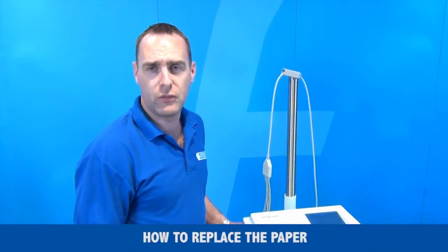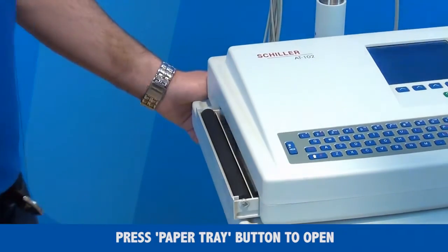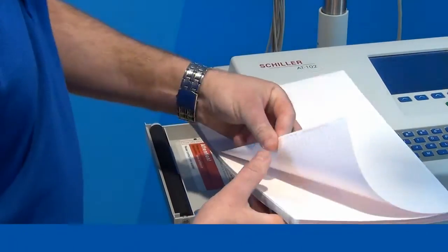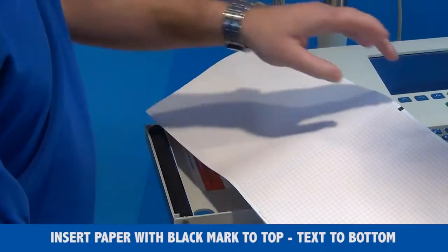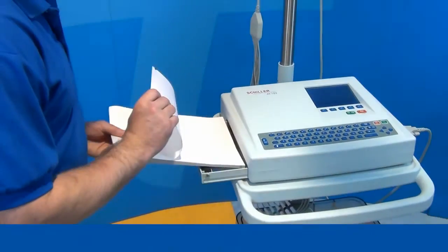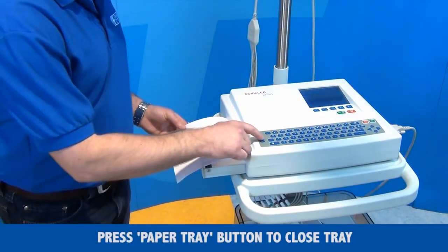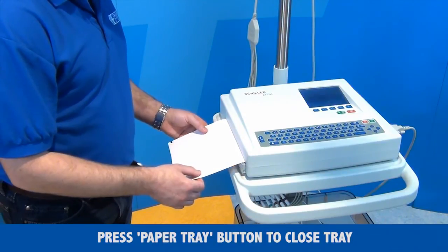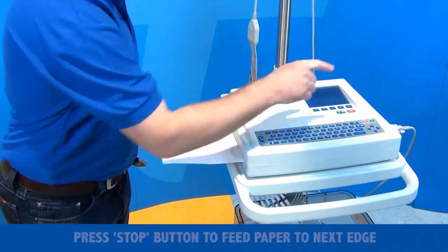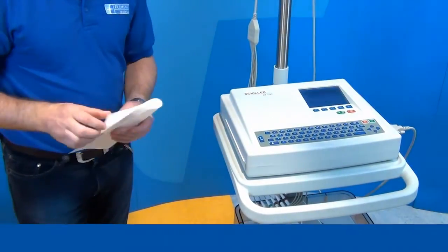How to replace the paper in the Shiller AT102? You press this button which automatically opens the paper tray. The paper starts with a black mark on top and the text along the bottom. The paper is dropped in. Press the button to close the lid again, then press the stop button to feed the paper to the next stage. Now you are ready for your next ECG.